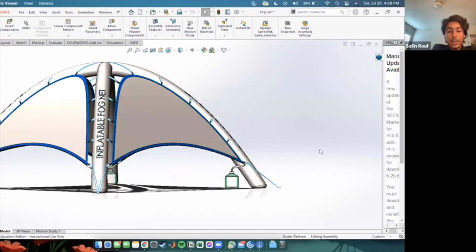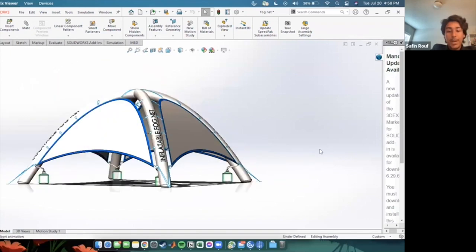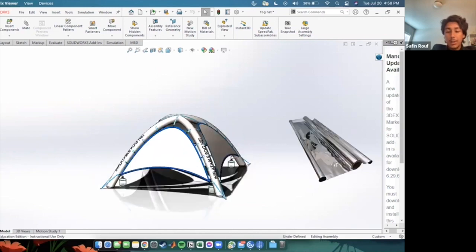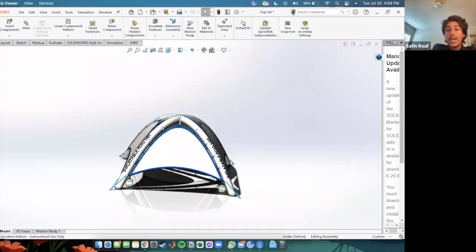The film itself functions optimally during sunlight based on previous studies, providing light intensity of 40 microwatts per centimeter squared per nanometer, well above intensive phototherapy. To compensate for periods with suboptimal sunlight, we will also be providing a material called mylar to place in the cot. This will act as a reflective surface to improve irradiance levels while also helping thermoregulate. Directions will also be given to caregivers for cheap, simple ways to thermoregulate, such as wrapping the child in a blanket if too cold. Now moving on to how we decided each individual specification for our device.